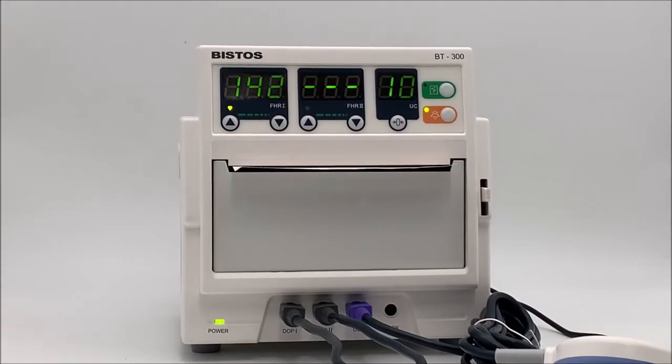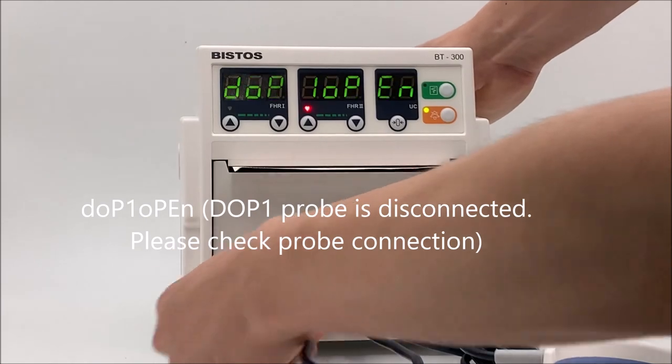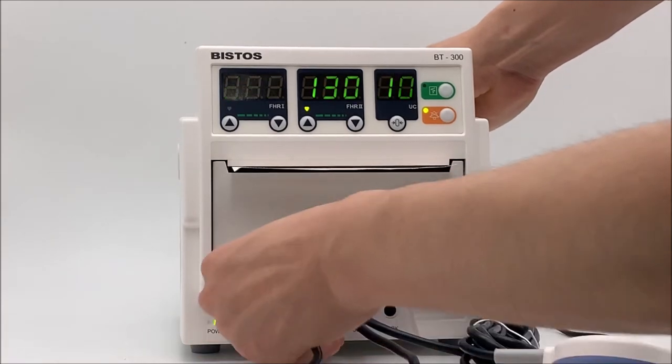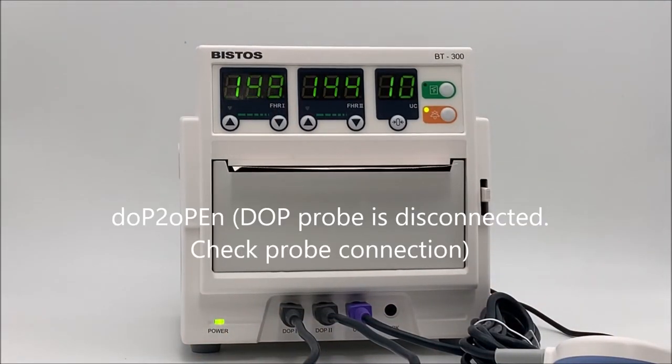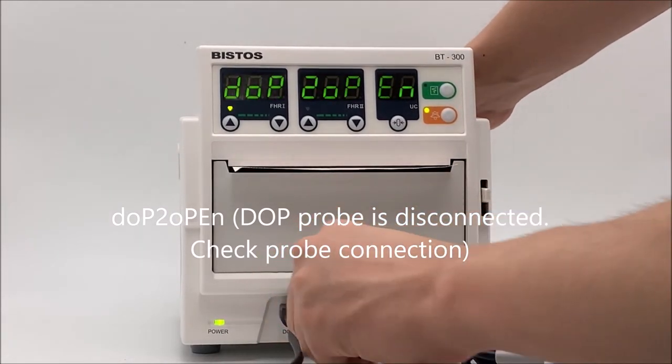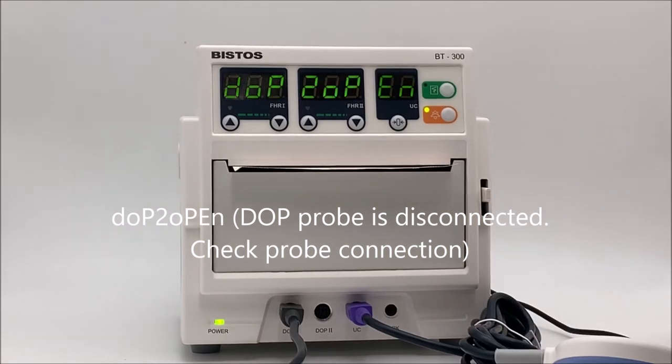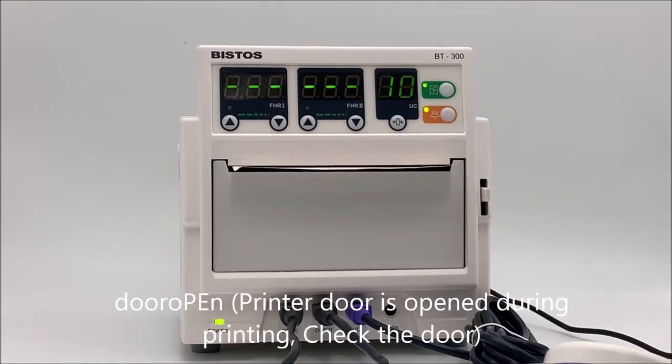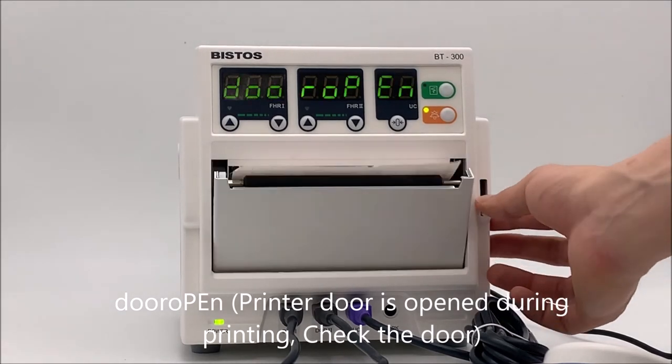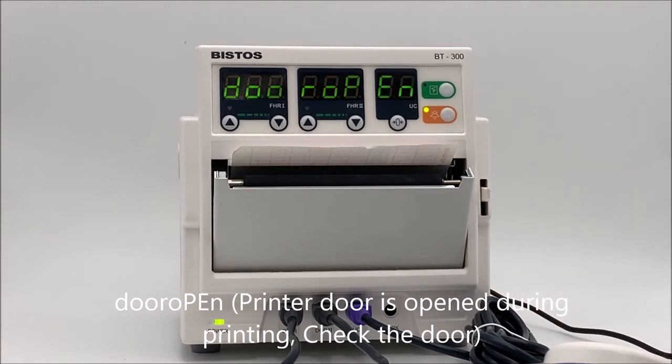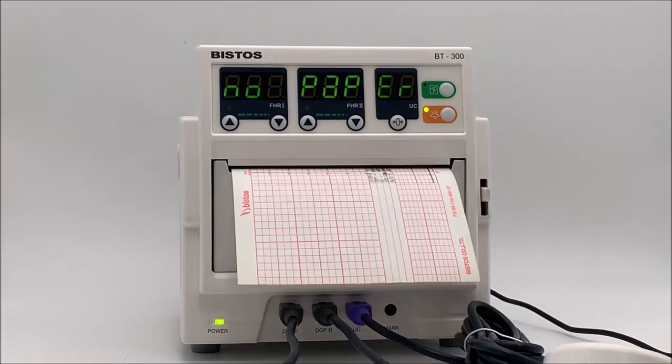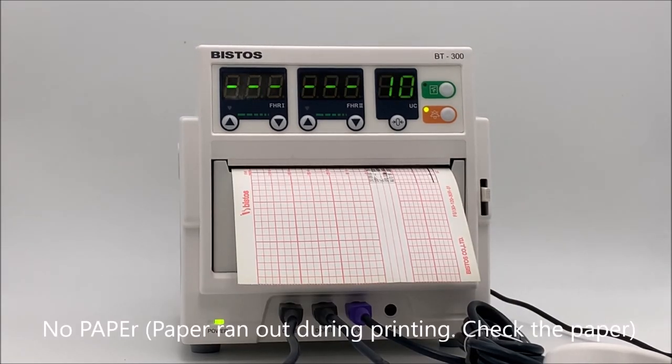Alarm message explanation. Doppler probe-1 is disconnected. Please check probe connection. Doppler probe-2 is disconnected. Please check probe connection. Printer door is opened during printing. Please check the door. Paper ran out during printing. Please check the paper.